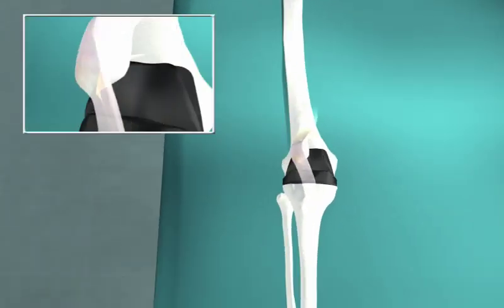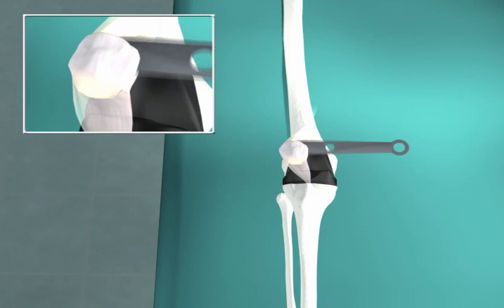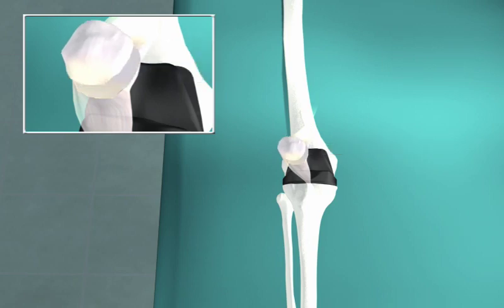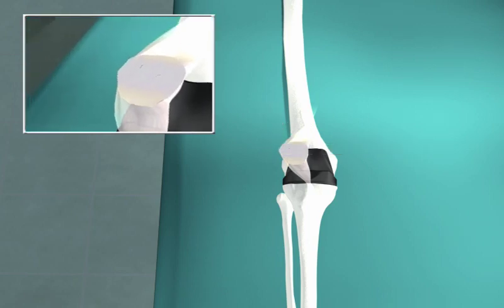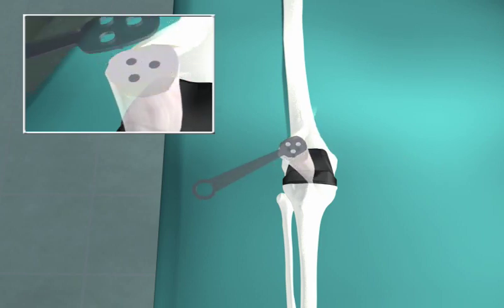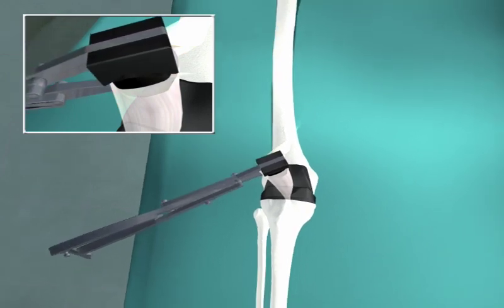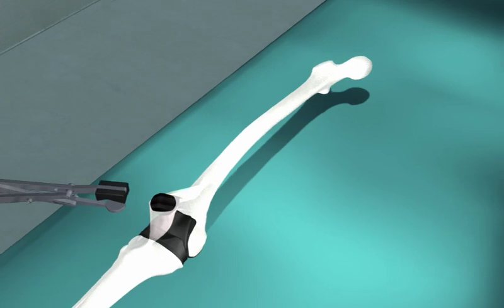The patella is everted, and when resected, is resected at the level of the quadriceps and patella tendons, respectively. The patella template is placed in its anatomical position, the patella is everted, and 3 marks are made to demonstrate the marking position of the trial patella component. The trial patella component is then squeezed into position with the patella clamp.